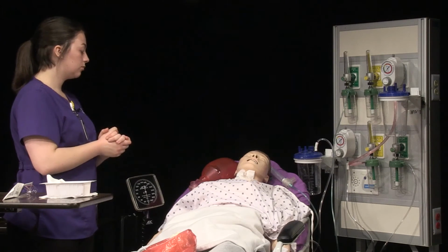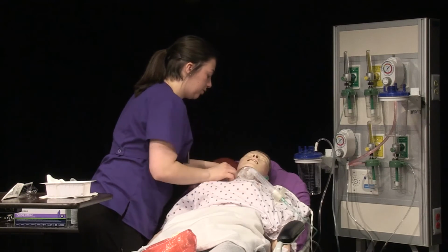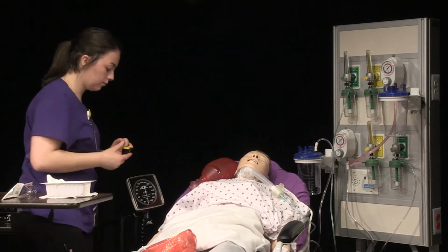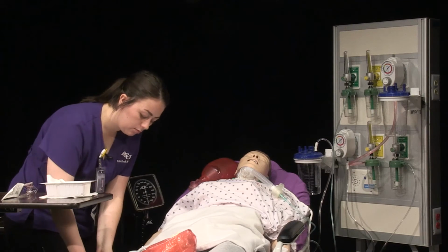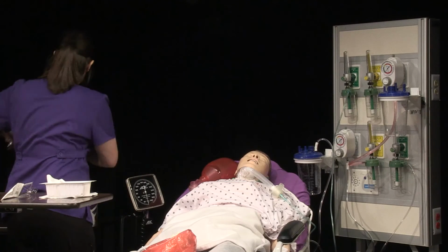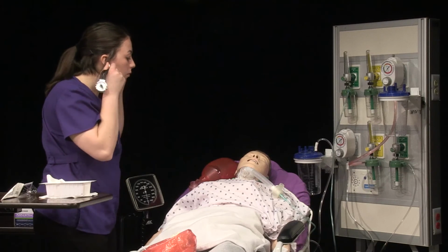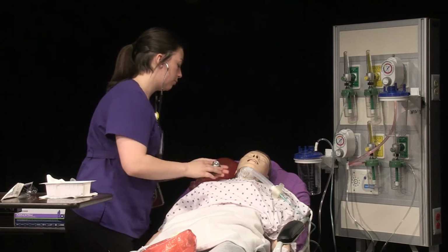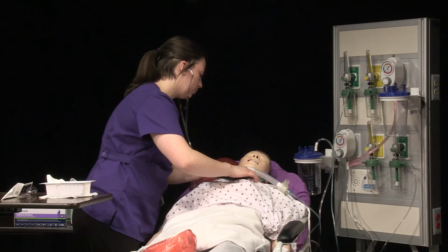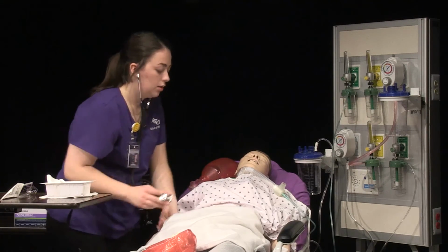Assess patient's respiratory status following the procedure. Ms. Roberts, I'm going to reattach your oxygen and then I'm going to check your pulse ox again, okay? So I'm going to put this back on your finger. All right, we're good. I'm going to take another listen to your lungs real quick. Take some deep breaths for me. And again. One more time.